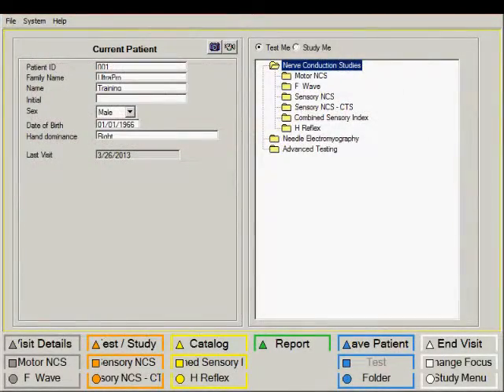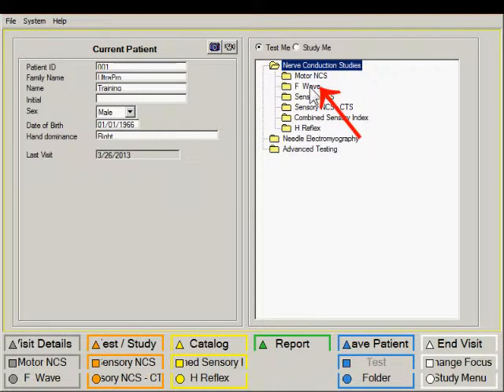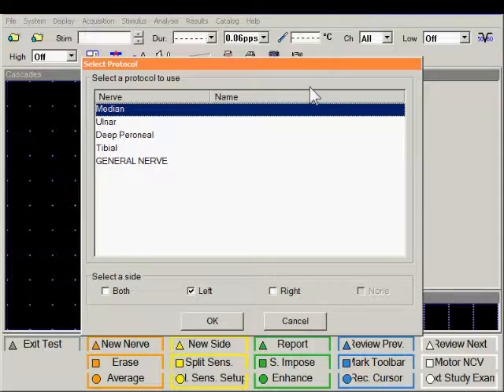Recording an F-Wave. The F-Wave test is found under the Nerve Conduction Studies. Select F-Wave.